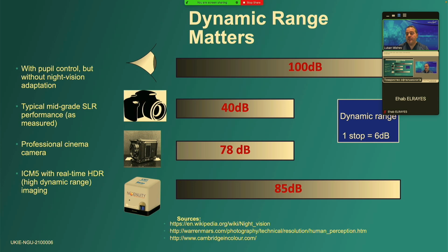Why are we talking about dynamic range, and what is dynamic range basically? The dynamic range is the ability of a single pixel from the sensor matrix to create meaningful image data in the lowest light conditions and in the highest light conditions. So you can think about it as a window of acquisition and the ability of the sensor to see more image data. The human eye has 100 decibels dynamic range, and in the cinematographic world, the dynamic range is measured in stops.